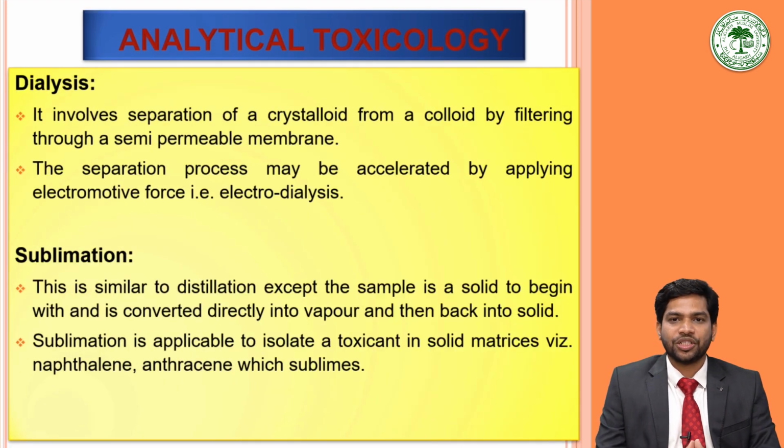Then another separation technique is dialysis. It involves separation of a crystalloid from a colloid by filtering through a semi-permeable membrane. The separation process may be accelerated by applying electromotive force, that is electrodialysis.